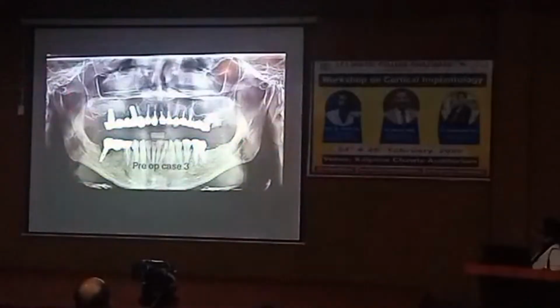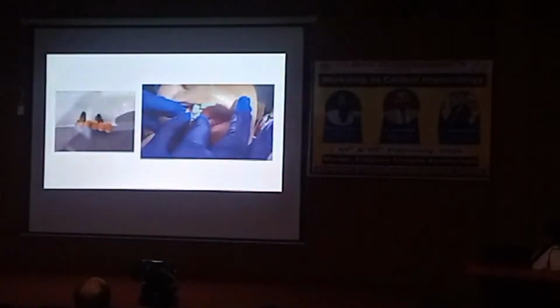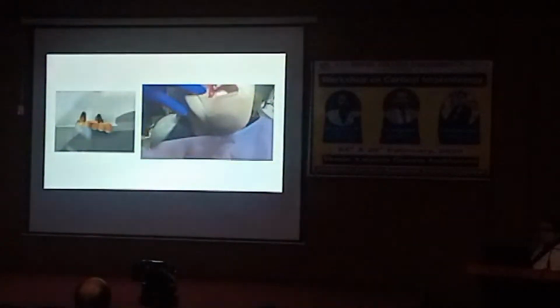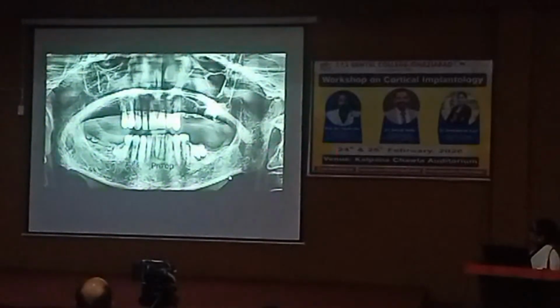Another case, another failed case of conventional. Sir already shown this. So high pterygoid, this is the case of high pterygoid where you failed. So this was the scene when the patient came in. Patient खुद से इसको अटका के रखा हुआ था 3-4 दिन से. So we moved it. We went for the zygoma because there was no bone in the sinus. यहाँ पे तो sinus खुला ही हुआ है. So this is the case of high pterygoid.